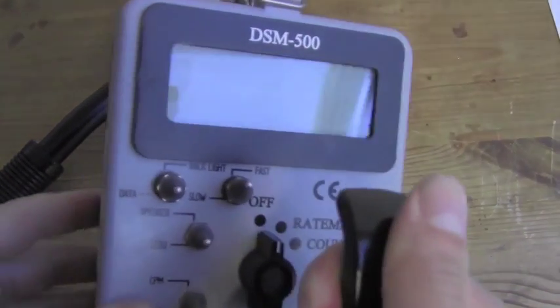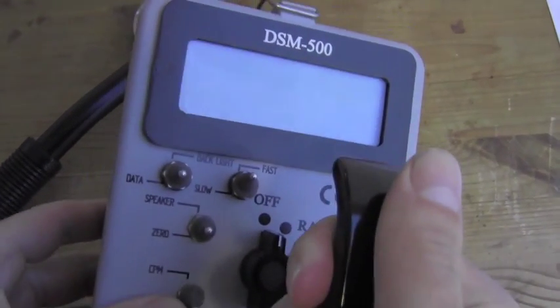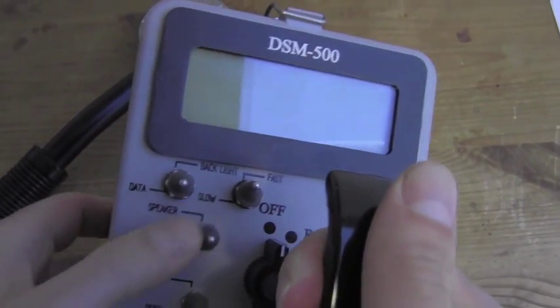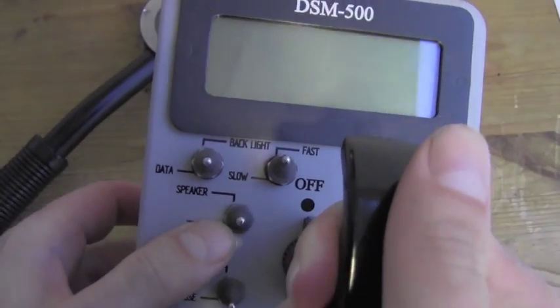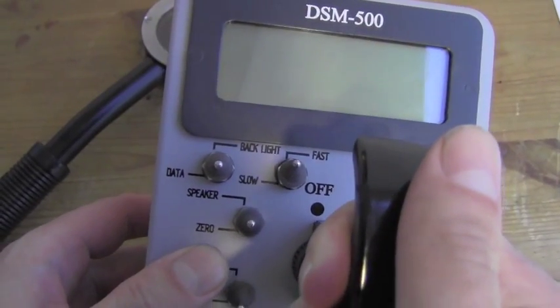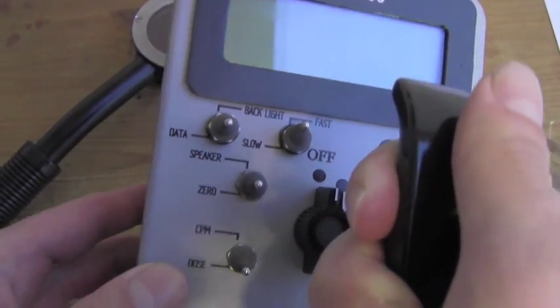It gives you the choice of fast or slow response via this switch, and we have our speaker switch to turn the audio on and off, and a zero switch.